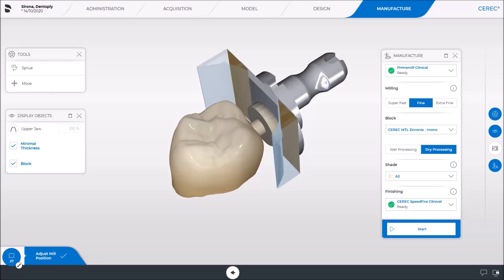A scan was already performed earlier and the restoration designed and positioned inside the block. Additionally, the devices needed for the manufacturing, CEREC Primil and CEREC Speedfire, were already selected from the marked drop-down menus. The green check marks indicate that CEREC Speedfire is turned on and selected. The CEREC MTL Zirconia block has been inserted in the CEREC Primil and the touch process was performed. Accordingly, both devices are ready for the manufacture of the restoration.